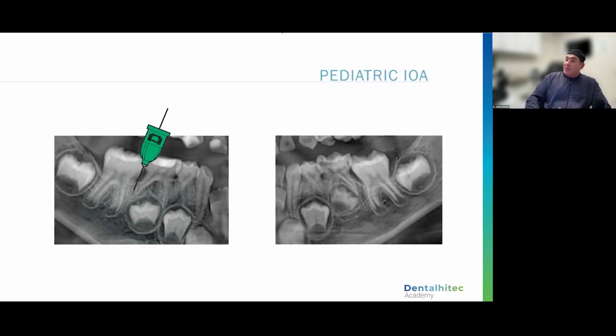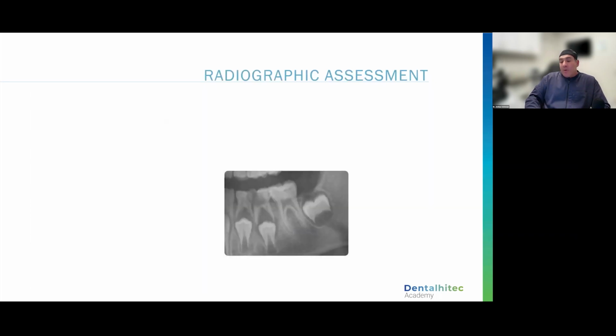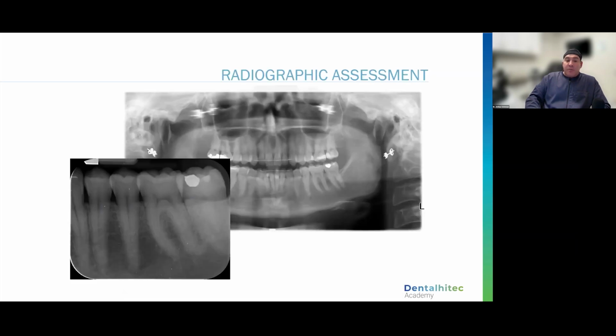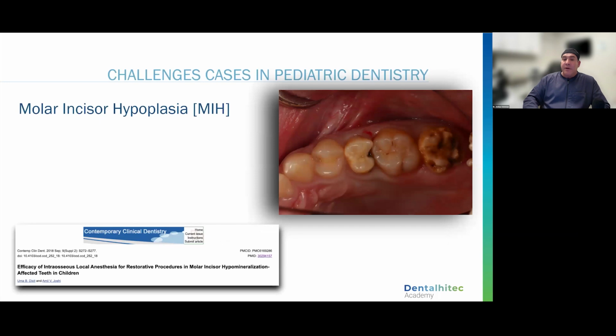If you have ectopic teeth, you may need to move your needle to one side or the other. You may be leaning slightly mesial, slightly distal. Now, again, 9 millimeter needle, usually not the case, but we need to make sure every single time that we're looking at our radiographs. For those adult patients, you remember, if it's a full adult dentition with a 9 millimeter needle, most of the time, you're only going to be able to give an interseptal injection. Choosing your site is something I want you to do. When you're new, maybe sit down the night before, decide where you're going to give that local, write it down.